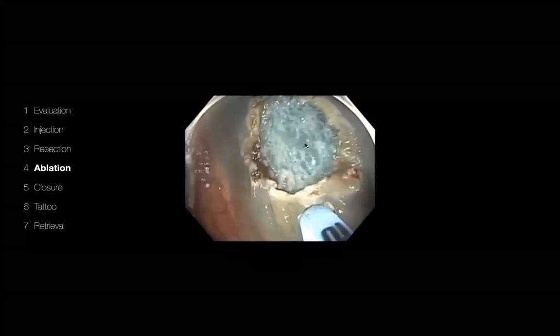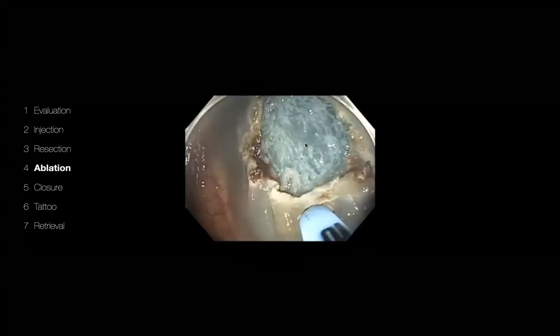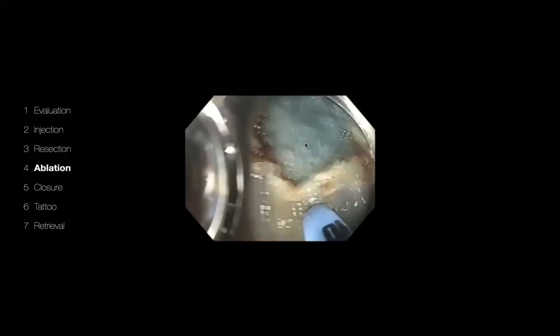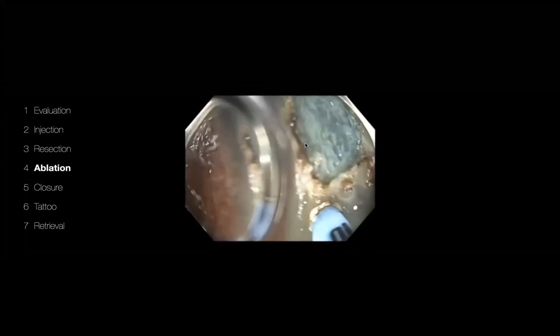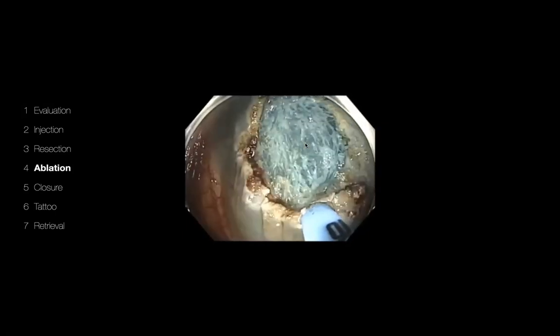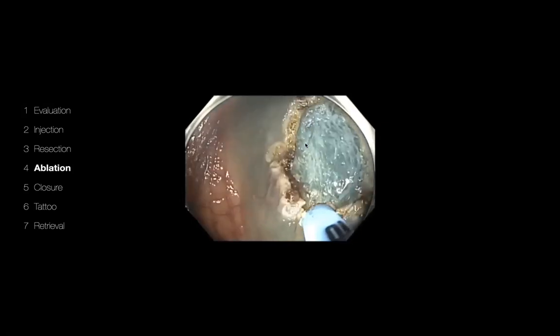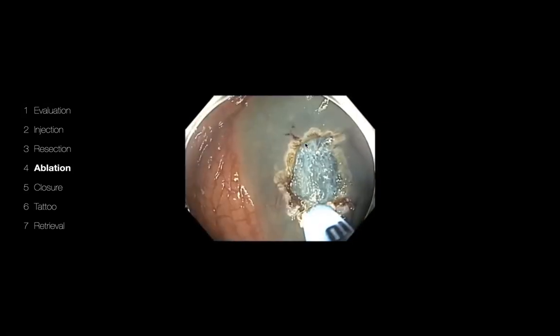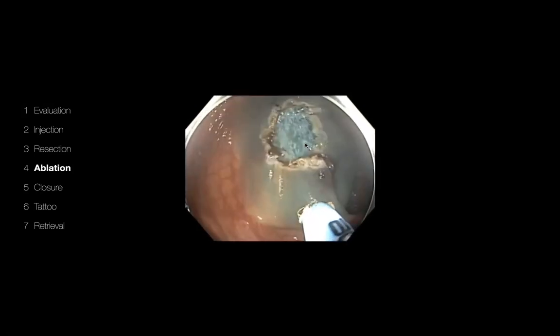Most of the recurrence was in patients that were previously resected and came back, or had an incomplete resection. But if you have a clean large polyp, 20 to 25 millimeters plus, and you follow the protocol, a clean edge, nothing in the base, and apply the APC, the recurrence rate is almost close to zero.